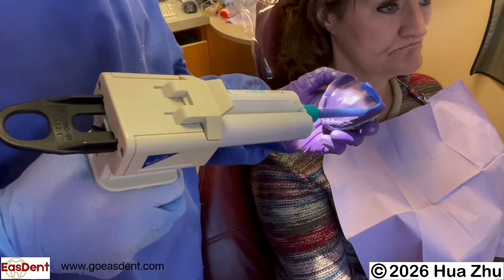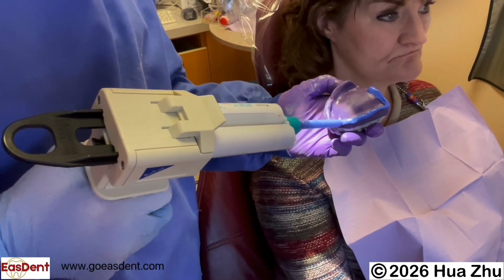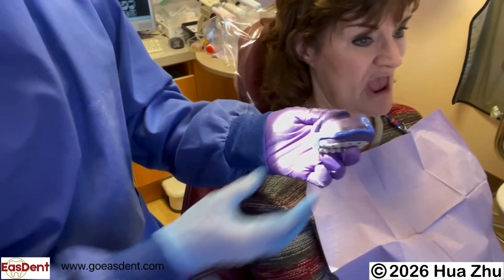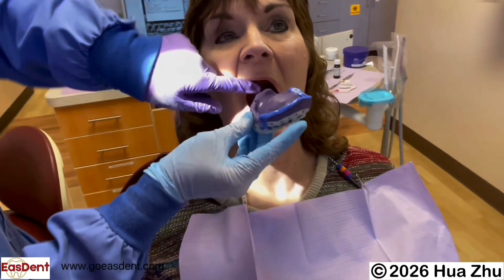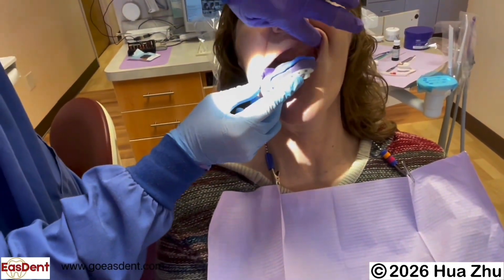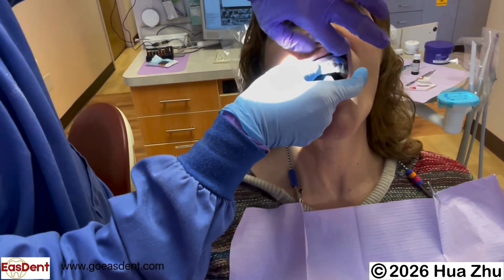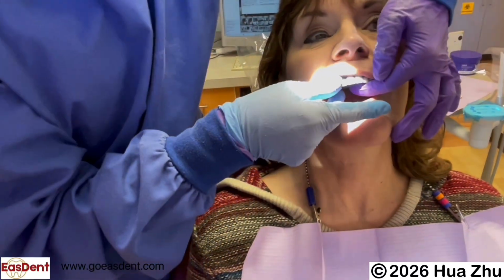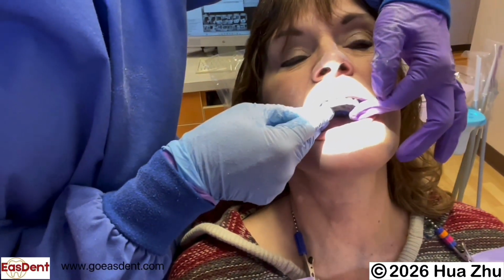Load heavy body PVS material at the periphery of the tray. It is easier to do one side at a time. Push the lip away using the side of the tray without impression material. Swing the tray into the mouth. Press hard to make sure the tray is seated completely and the Easdent teeth remain in the correct position.